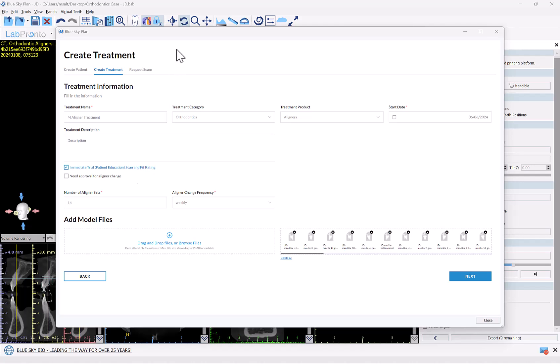This checkbox sends an immediate prompt to the patient to do the first scan. Even if the first scan should be at the end of aligner one in two weeks, it will still send an immediate prompt for an essentially demo educational scan so the patient can be familiar with the scanning process in your clinic. 'Need Approval for Aligner Change' activates a process where the patient won't be told to change their aligners until you review the incoming scans and approve the aligner change — once you provide your approval, the patient receives the notification to change to the next aligner.